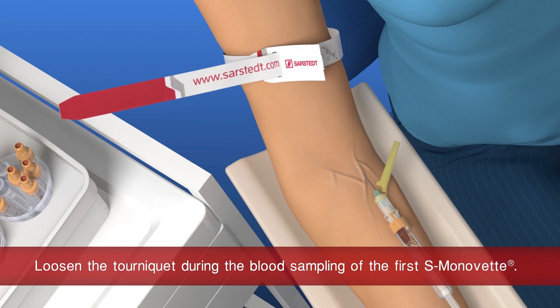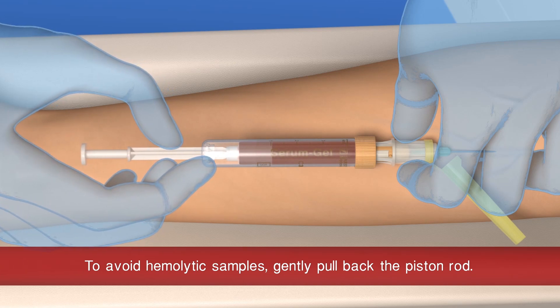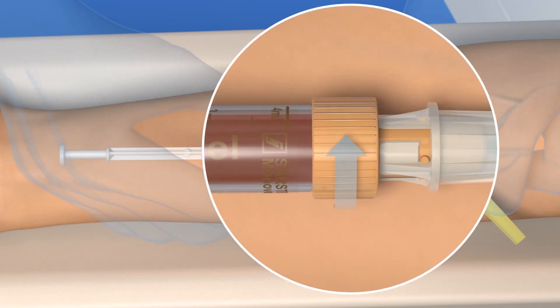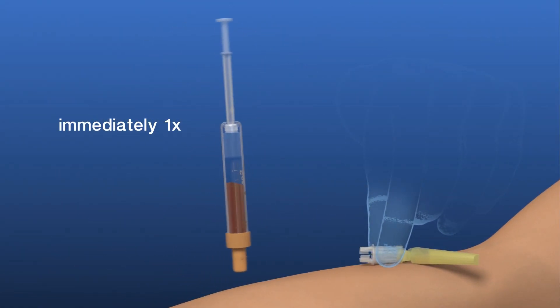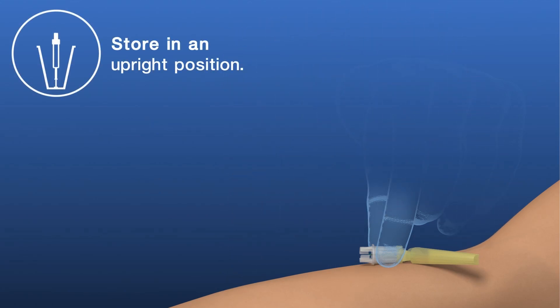Loosen the tourniquet. To avoid hemolytic samples, gently pull the plunger until it will go no further and wait until the blood flow stops. Rotate the S. Monovet anticlockwise to remove it from the safety needle. The safety needle will remain in the vein. Now invert the S. Monovet once and store it in an upright position.